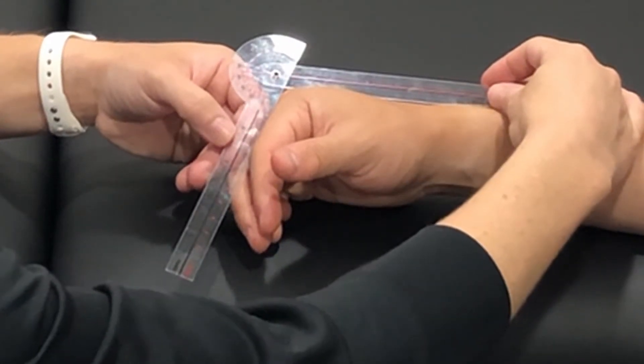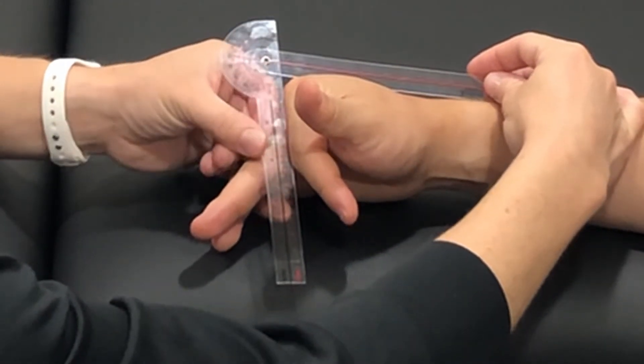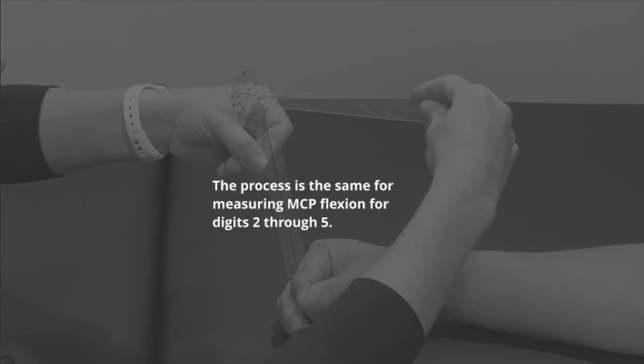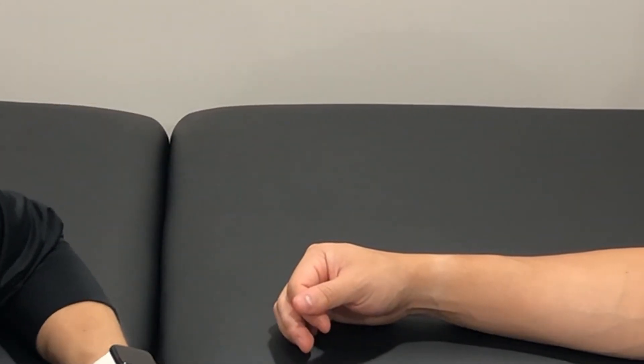Go ahead and curl your finger down. And that is measuring flexion of the MCP joint.